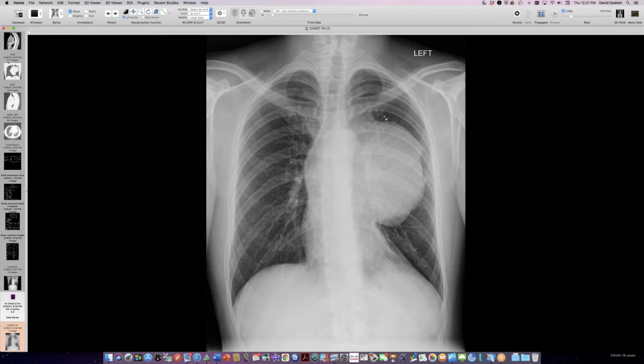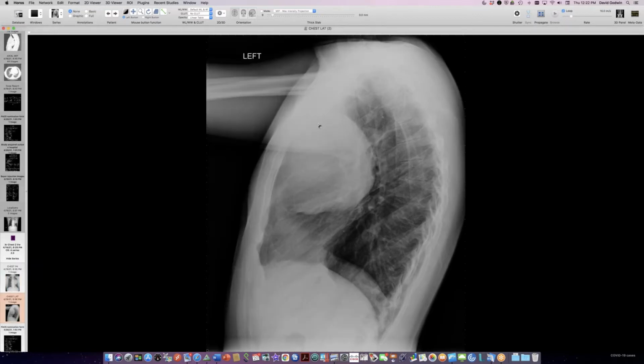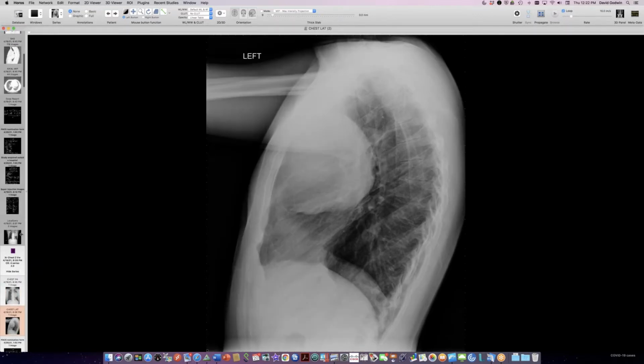So a mediastinal mass, I think in a 29-year-old here, this very well-defined mass, and this was April. Already this month in May, this thing is much larger. It's probably twice the volume already. So this is a rapidly growing mass here. Just in case you think it's an artifact, I think this helps confirm that it's an anterior mediastinal mass.